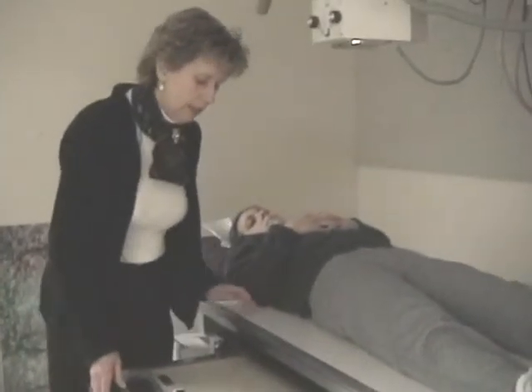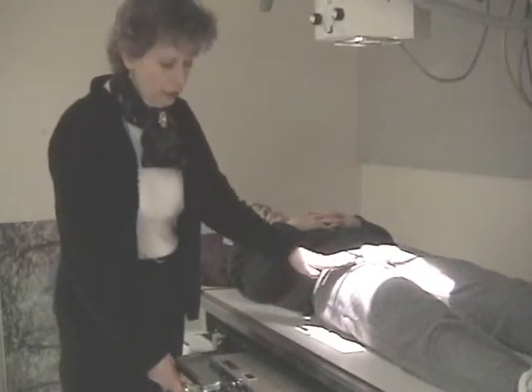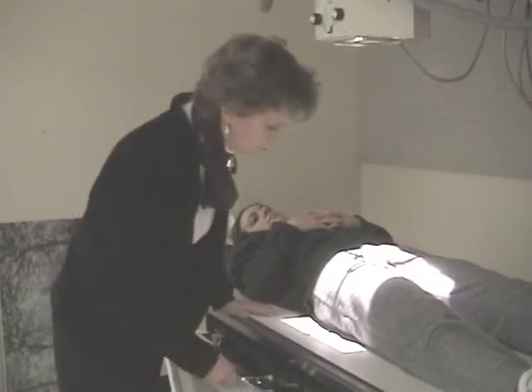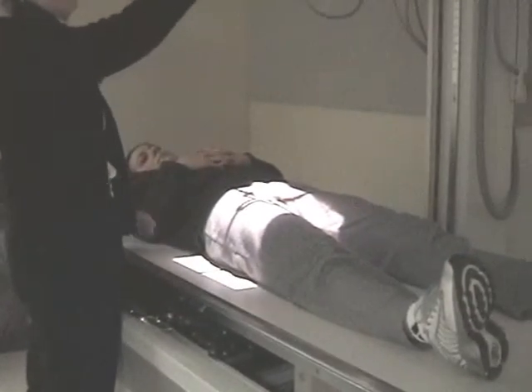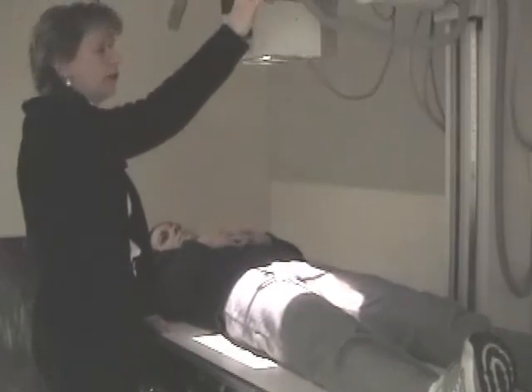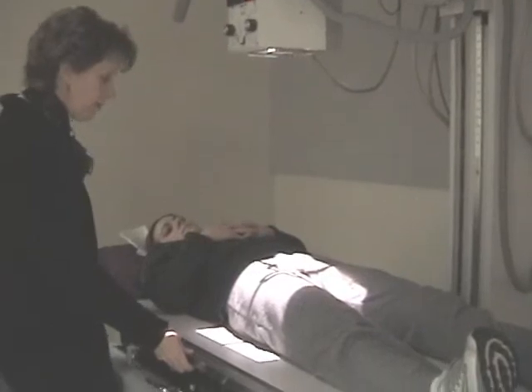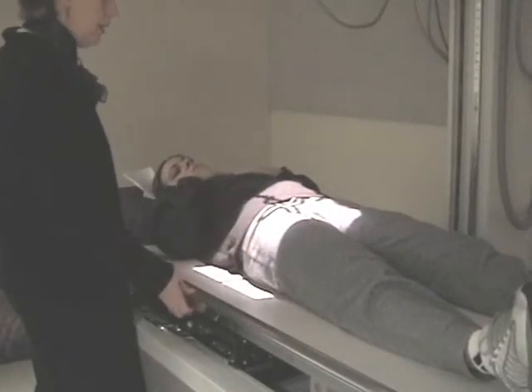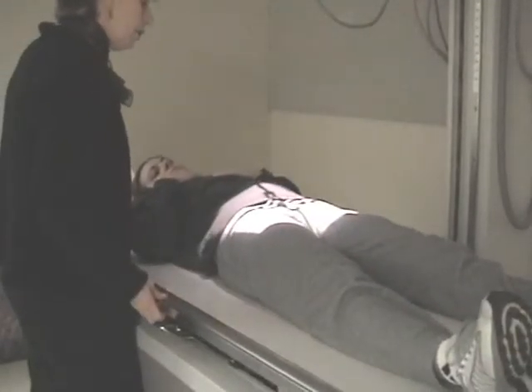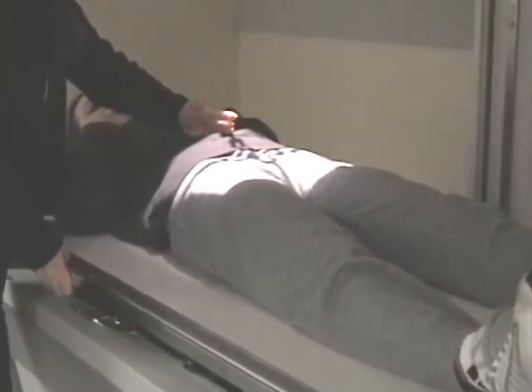I can push the cassette in because this is a floating tabletop, and I have the tube lined up with the film. And I have my tube transversely centered. I have 40 inches SID. And all I have to do now is float my patient, and I'm going to get her mid-sagittal plane to the center of the film. I'm centering over the pelvis region, and I'm going to float the table to get the mid-sagittal plane to the center of the film here.